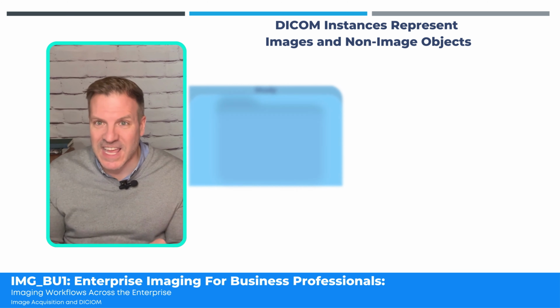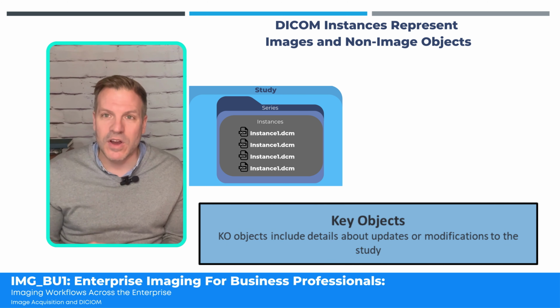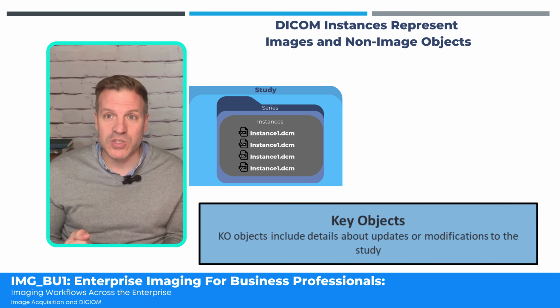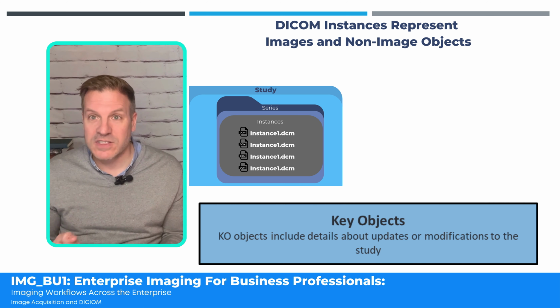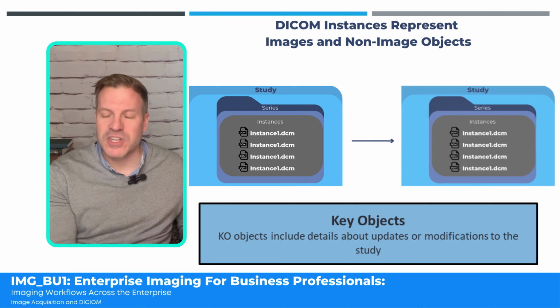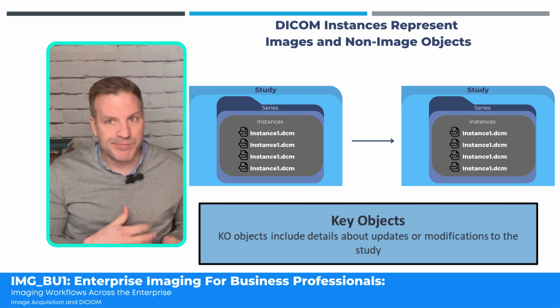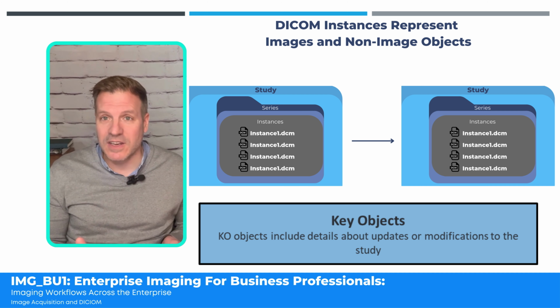And then finally, there's a key object. An example of this is where we could be using this for quality control or change management. It's not uncommon that we have scanned the patient, we have sent the images to the PACS, and we realize that 5 of those images need to be deleted.